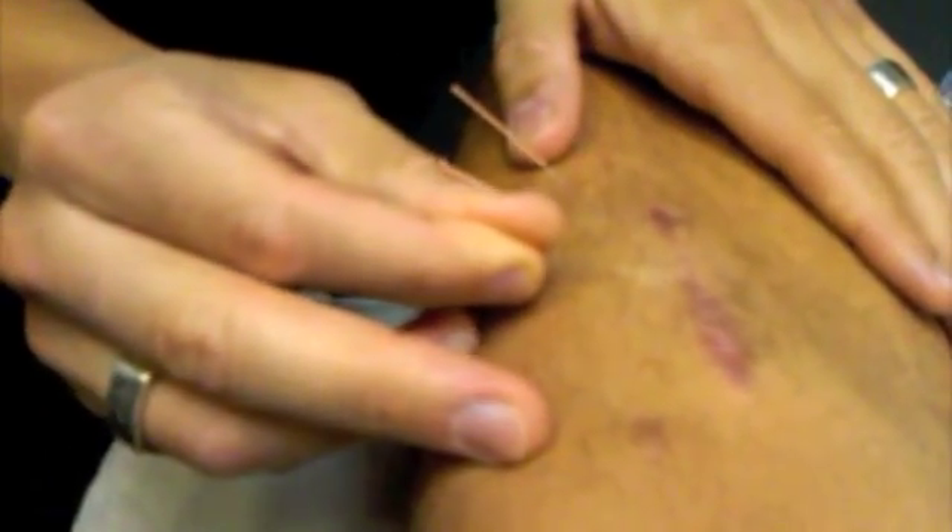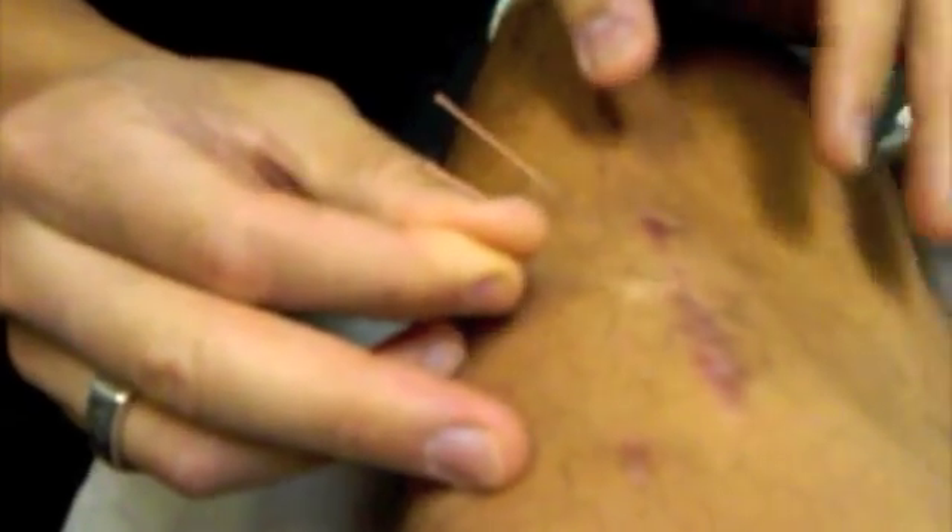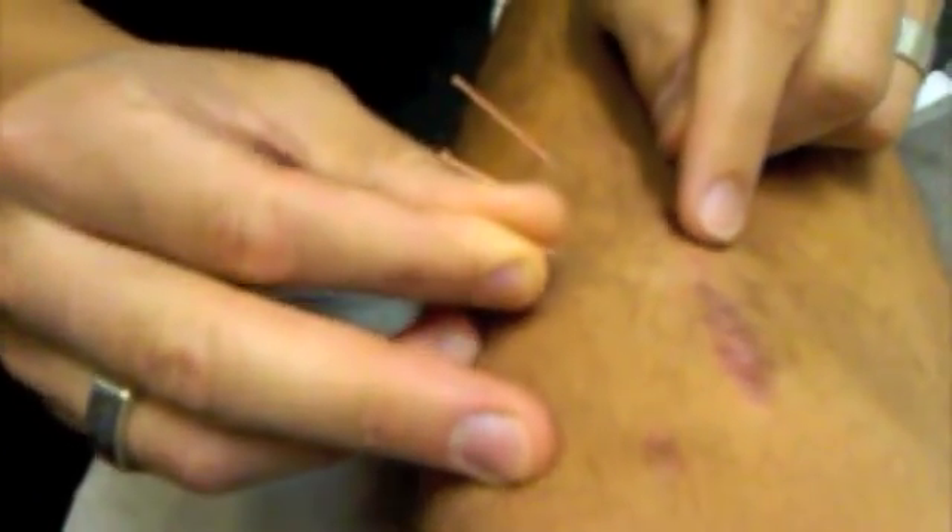And now if I use that needle to tug on the tissue, you see that the scar becomes mobilized. So what I will do is twist the needle, then tug, and do so in various areas around the scar.